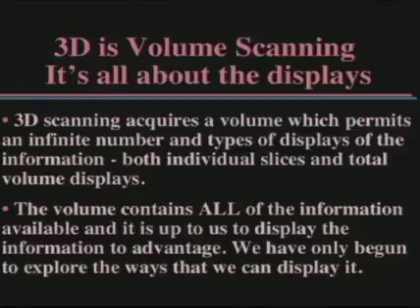3D is volume scanning. And it's all about how we can display that volume. With 3D ultrasound, you acquire an entire volume, which then permits you to render an infinite number of slices within the volume and types of displays of the information.